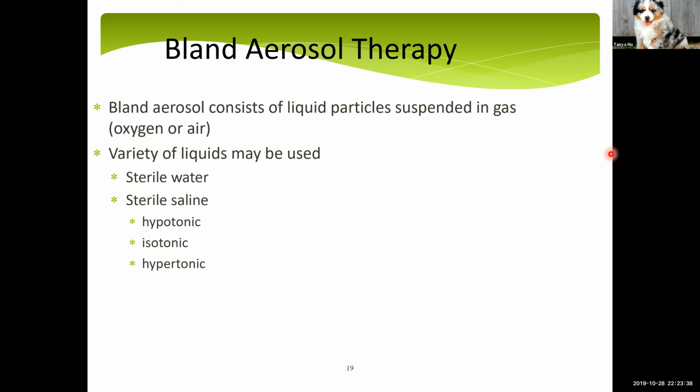One of the big differences, and why it's important, is that depending on the system you're using, water vapor is not supposed to be able to carry pathogens. Aerosols and condensate can carry pathogens.